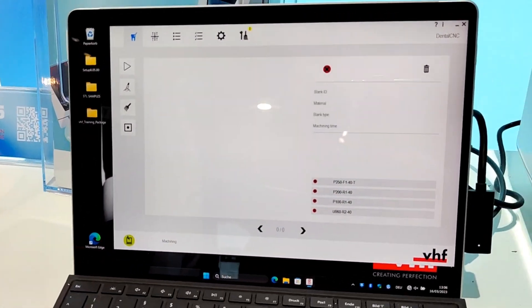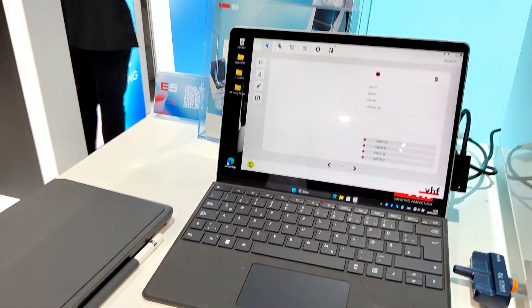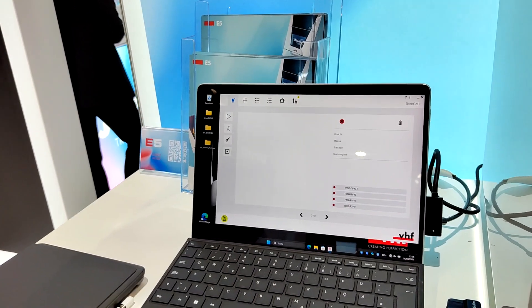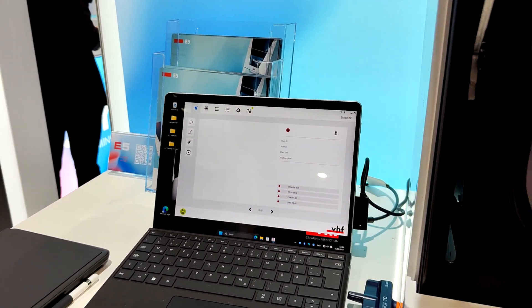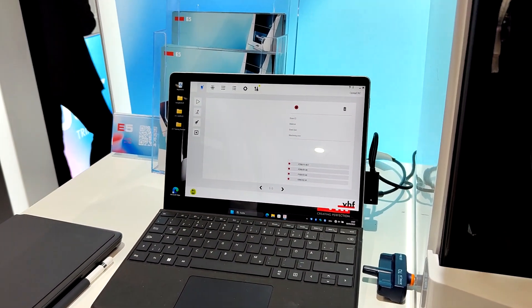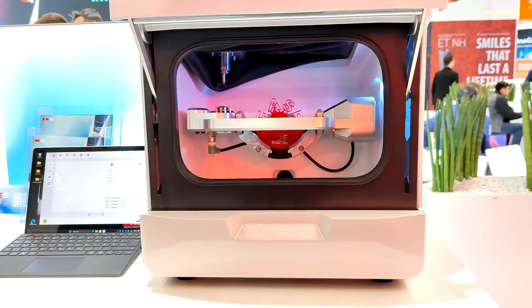Customers can import any STL file, and the software automatically detects screw channels and mills them perfectly — including secondary constructions like Zirconia frameworks with predefined screw channels. The milling quality on the E5 is the same as VHF's top models, the R5 and K5 Plus — no deficits whatsoever. It's the same VHF technology.